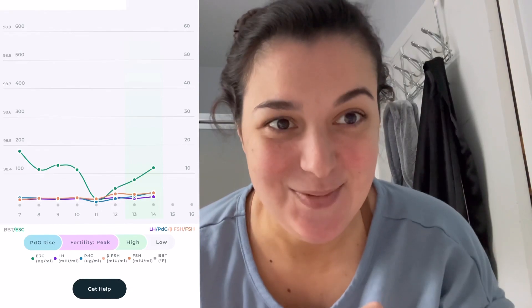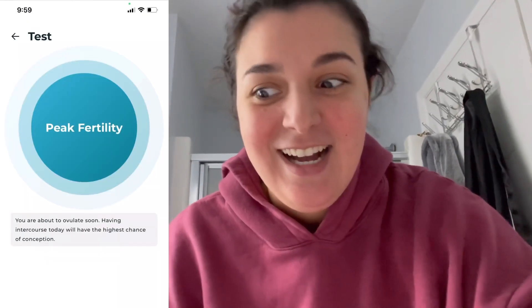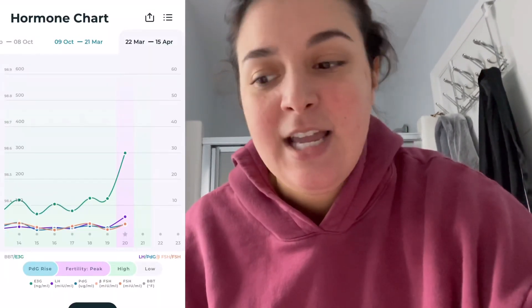It is cool to be able to see it and know, and it's also helpful because if we were trying this cycle — which we're not — I would know exactly when to do it. My levels finally started to move a little bit and we are officially in high fertility. We are finally at peak fertility and I am so happy. I was kind of worried that it wasn't going to come because I was in high fertility for a couple of days, but I love that it differentiates between high and peak fertility.